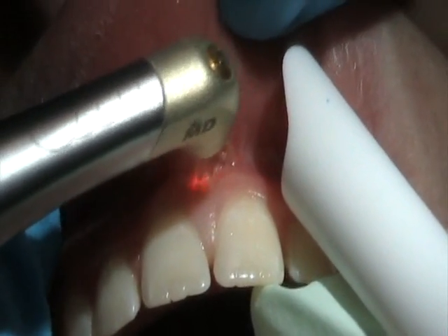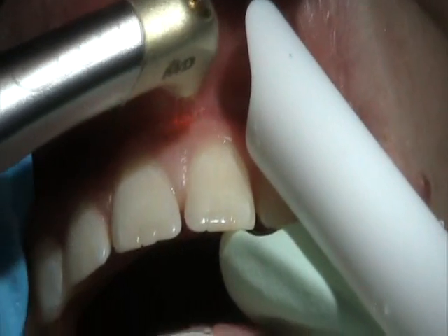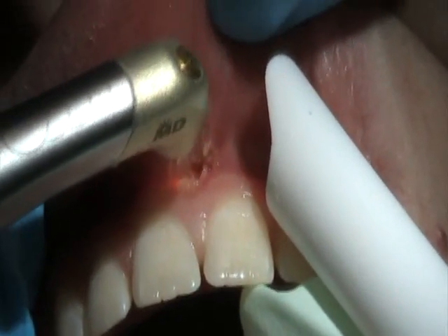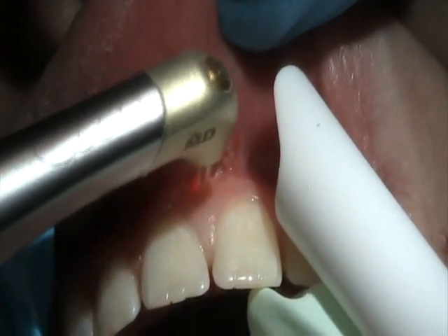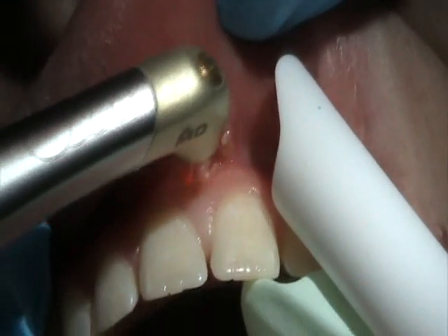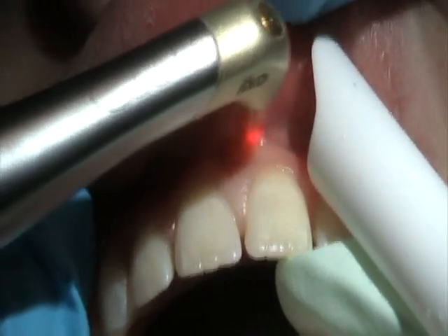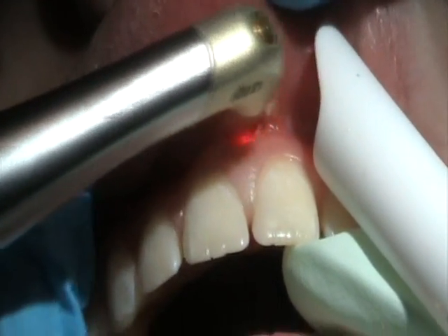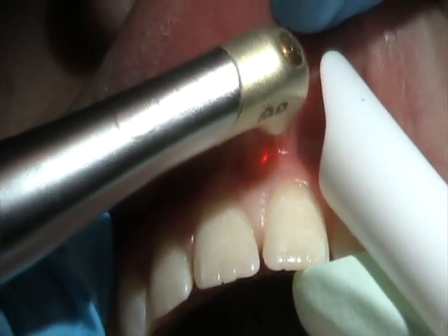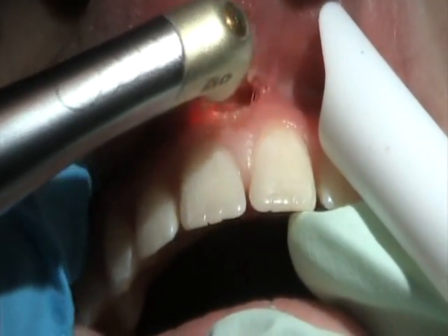The rest of it you had on S mode? Yes. The initial cutting was all on S mode, a little higher power, about 1.75 watts. Now I'm lightly touching the bone, just going through the fibers back and forth, getting closer and closer to the periosteum. I'm on the periosteum now. Still a little hang-up here. You want to make sure that goes straight through with no hang-ups. All with the C6-9 millimeter tip.